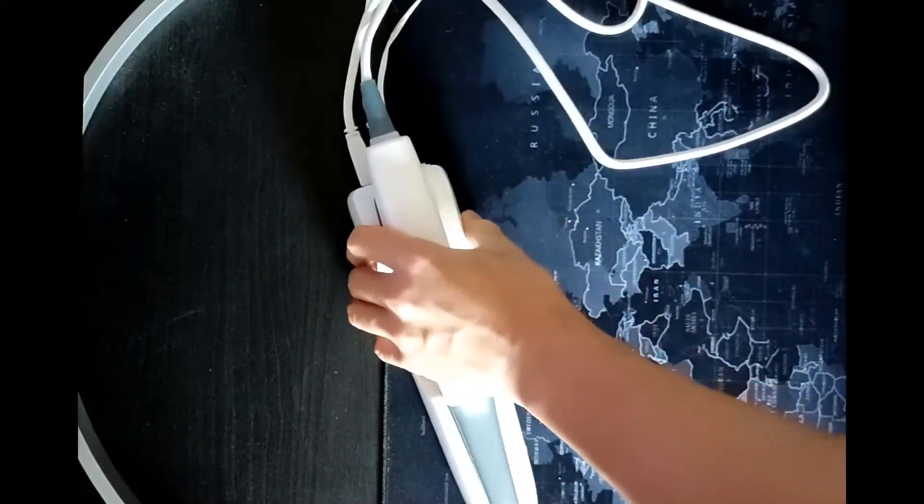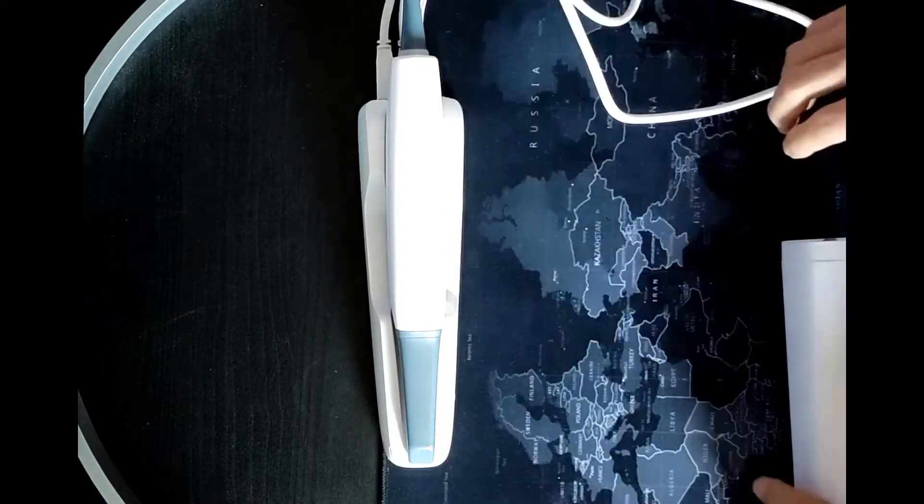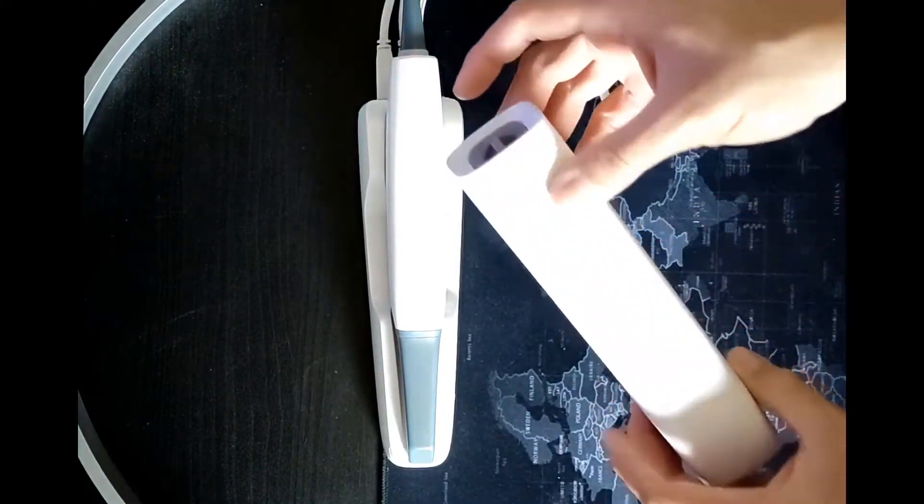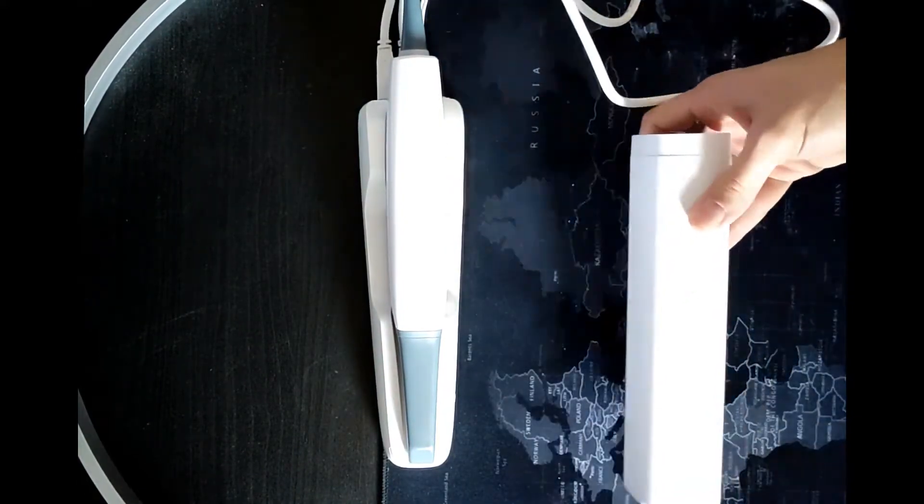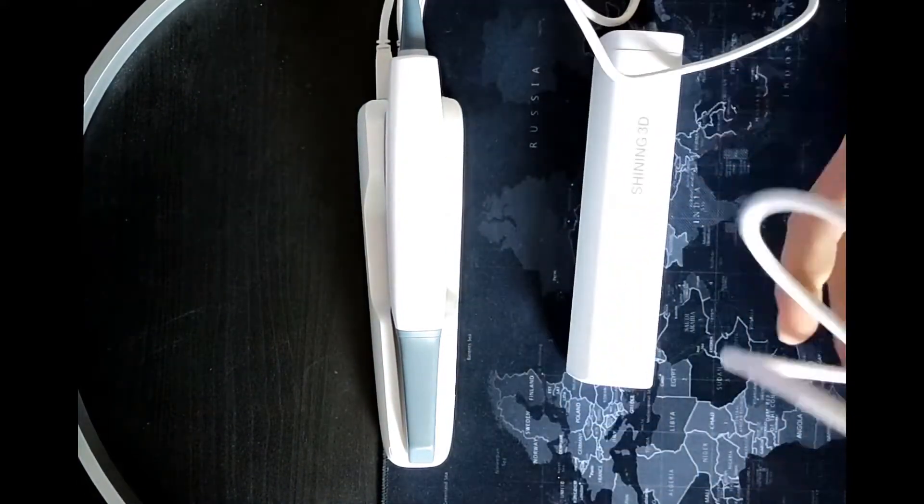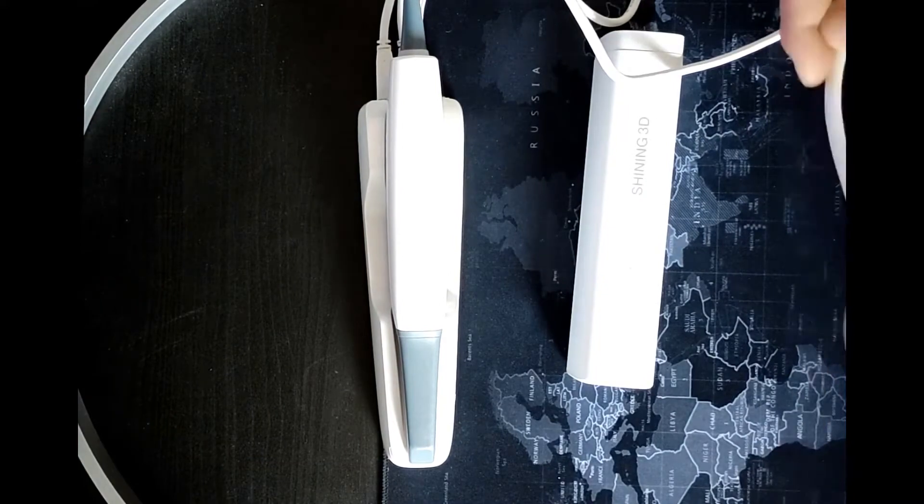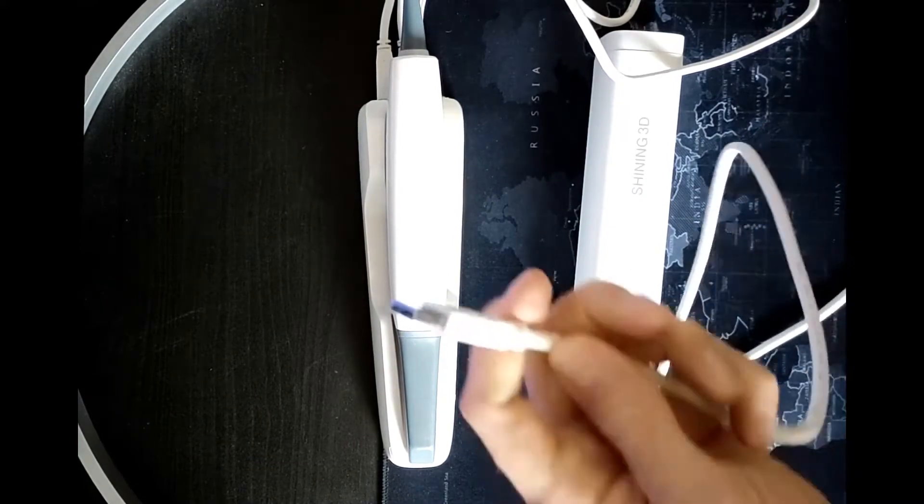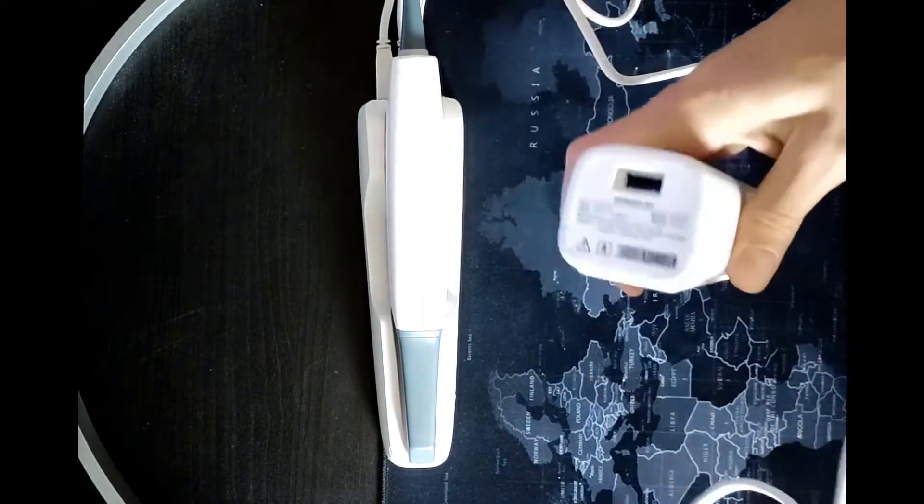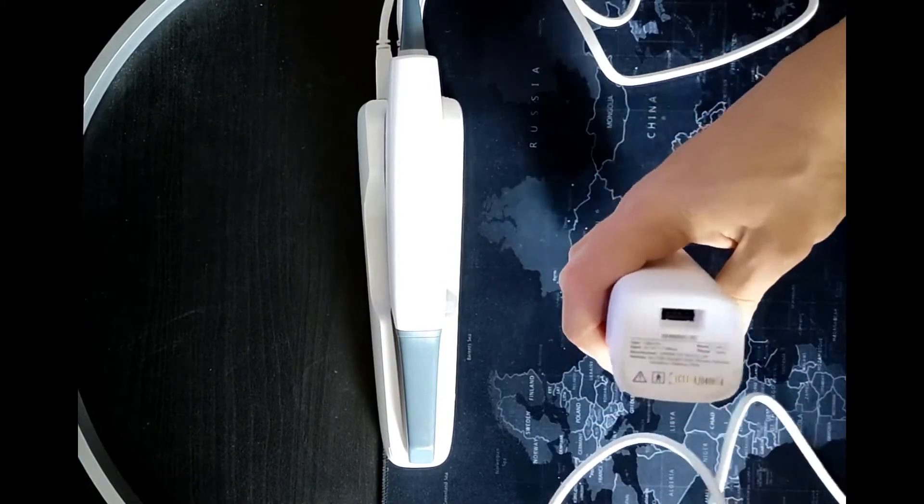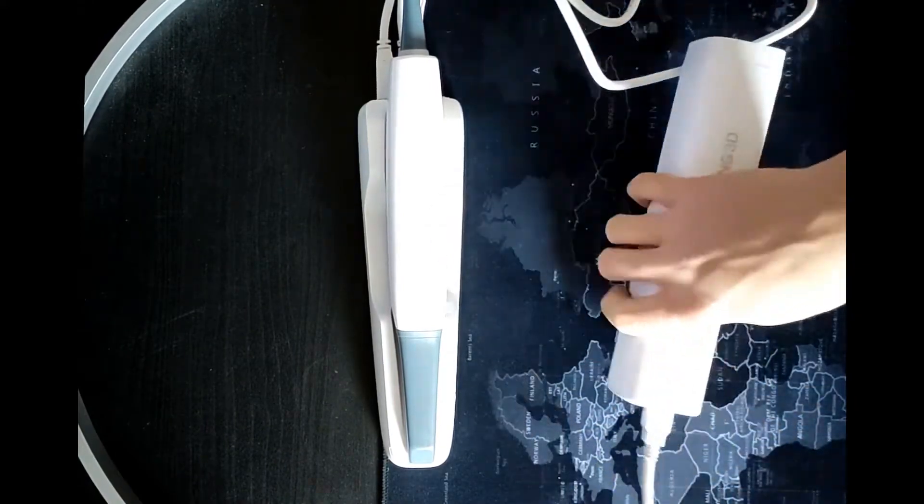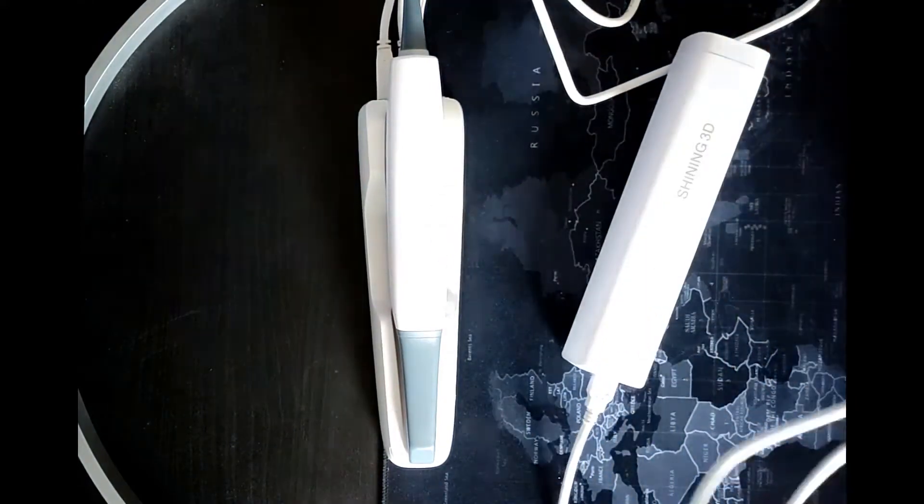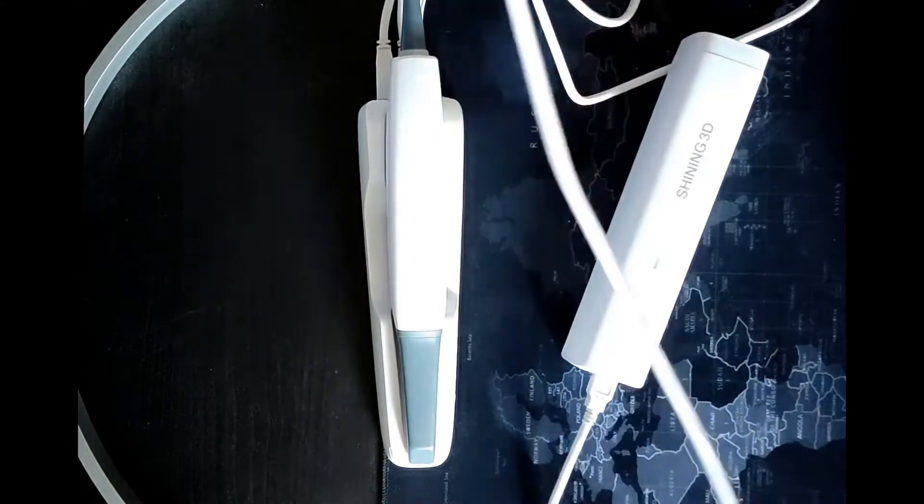In case it's your first time unpacking and installing the scanner, it's necessary to perform the calibration. In order to perform the calibration, it's necessary to connect the USB cord to the calibration tool and the other side of the cord directly to your computer.